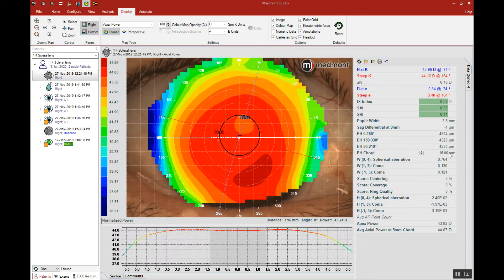In the case of the lens I use frequently, it's a 16.3 millimeter diameter lens that bears at 14.8 millimeters, and that's where its sagittal depth is calculated from. So the important number to remember is to enter the value that your scleral lens calculates its sagittal depth over.